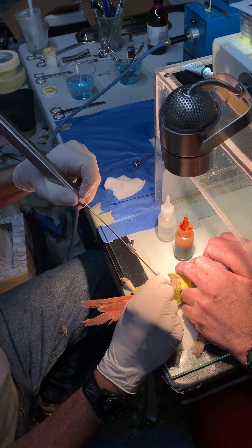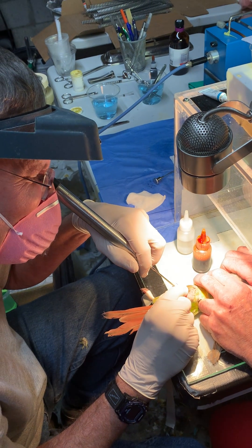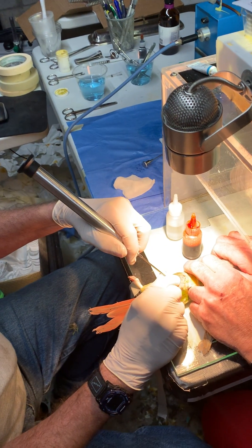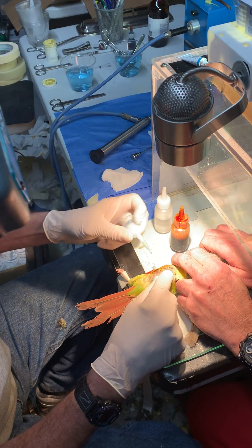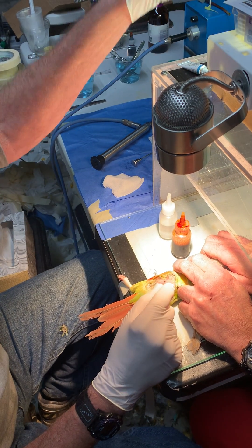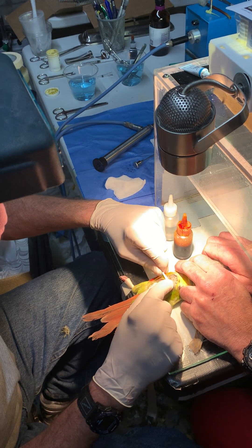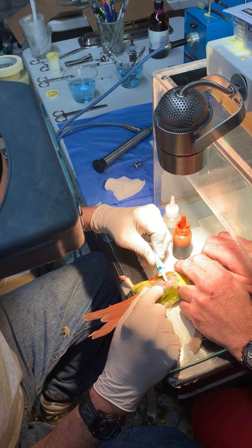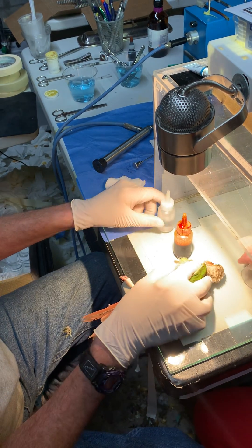Now we're taking a small human arthroscope and taking that down through the cannula. We have a mature female. If there's no bleeding, we use some skin glue just to seal the hole, then take a q-tip to push the skin edges together. We put a dab of antibiotic on there, and then the bird is marked.